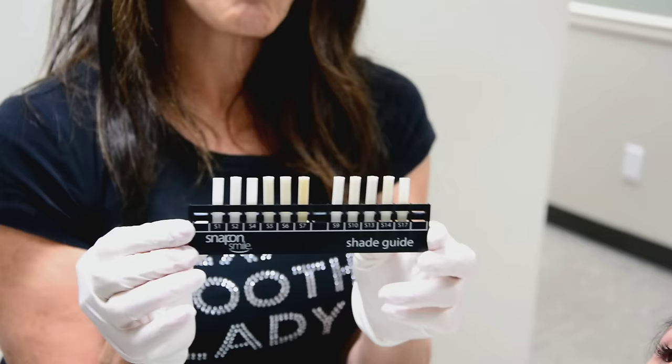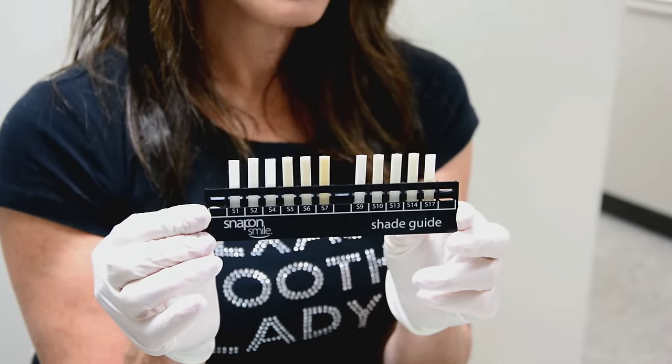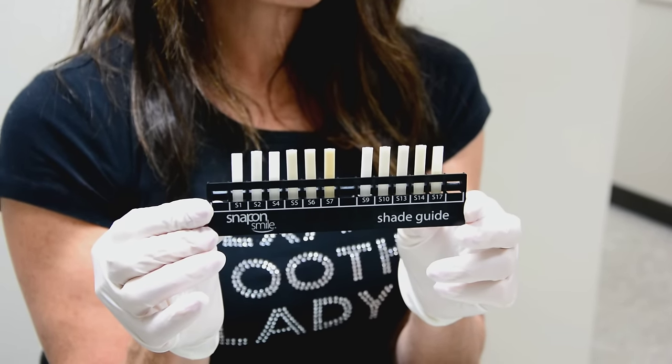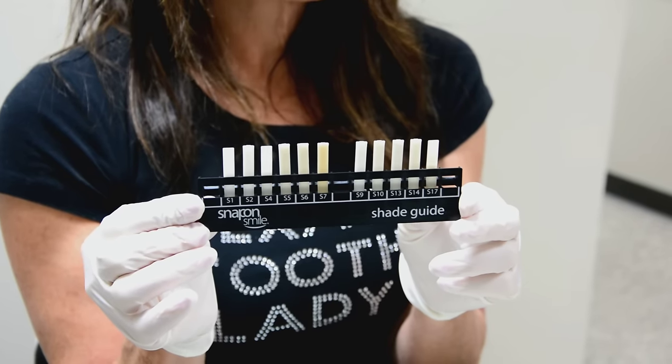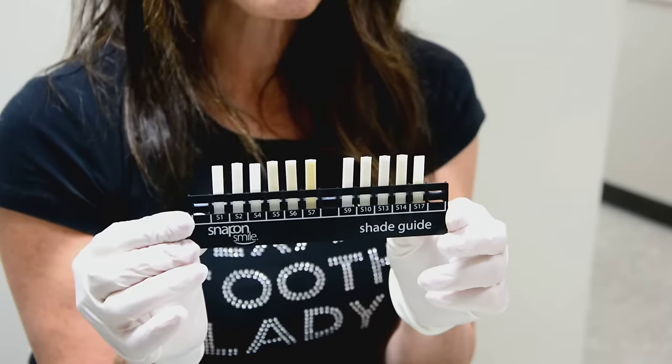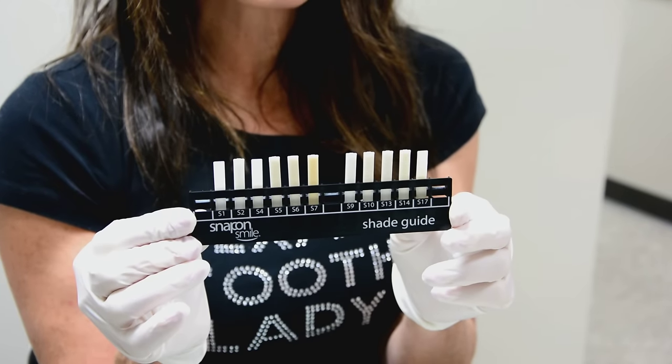Our next step is to pick the color — the right shade for the snap-on smile. You must have the snap-on smile shade guide. We find that most patients choose S9 or S10 — those are our most popular colors.